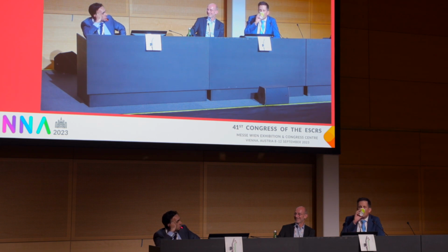But just on that note, nighttime driving, and photic phenomena, because obviously this is an issue when you're driving. That's something you both must consider when doing cataract surgery in that population group. Would you feel that this may be a nicer option with respect to that compared to, say, a diffractive trifocal lens? Yep, probably yes.